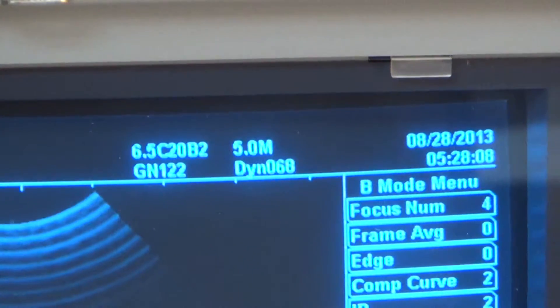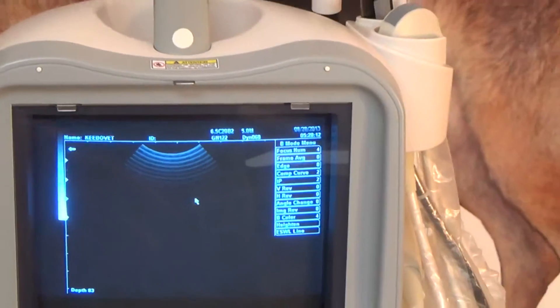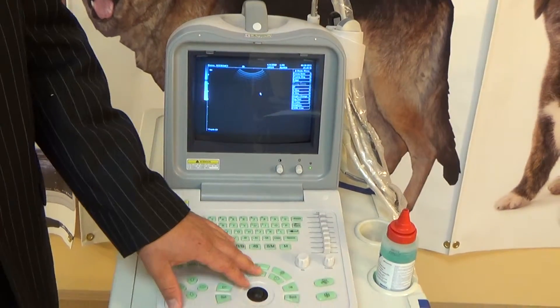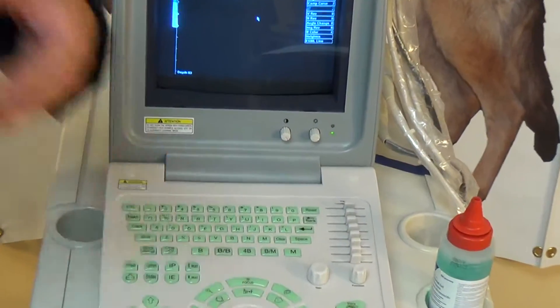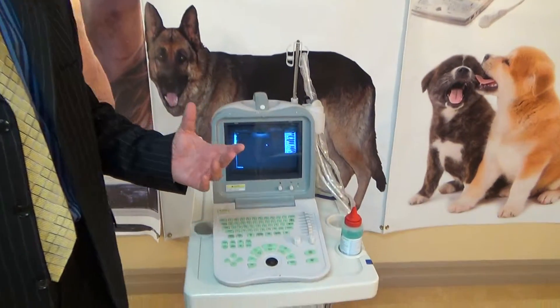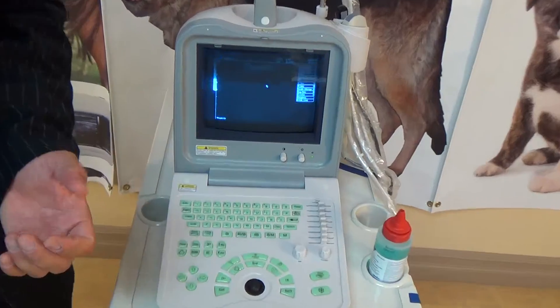The higher the frequency, the better the resolution, but the less depth you can see clearly. If you want to go really deep — for a really large animal — you'll decrease the frequency to a lower setting so that you can go deeper and still get good resolution, though it will not be equivalent to the resolution you'd have at 9 megahertz.